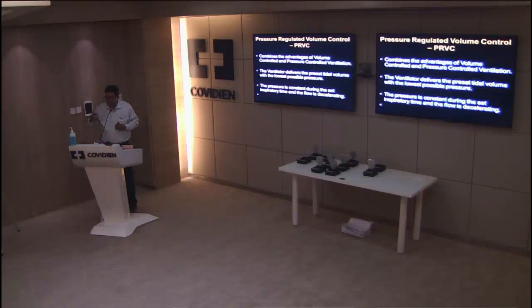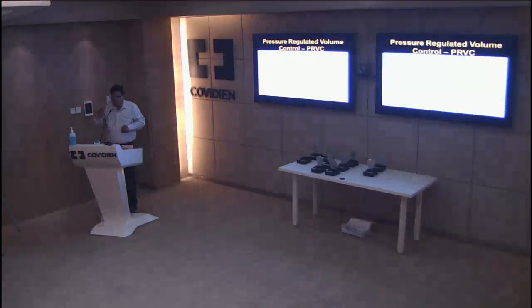So similarly, when you have pressure support, I'll talk about pressure support, there is something called volume support. So basically, it delivers whatever tidal volume that you have set. You have kept a tidal volume of 400, 450, whatever. It delivers the tidal volume in a pressure control kind of delivery at the lowest pressure possible. So how does it do that? Basically, initially it gives what's called a test breath. It gives a test breath of 450 ml, in a volume control breath.